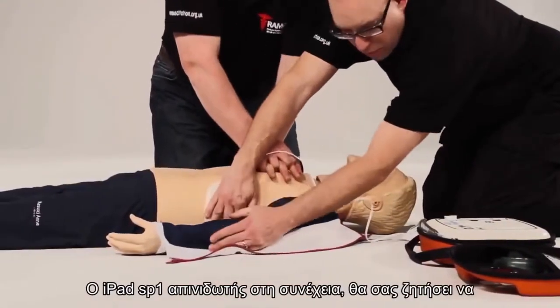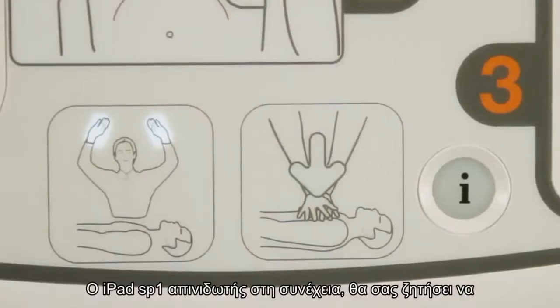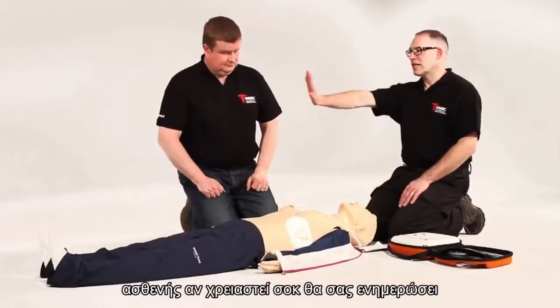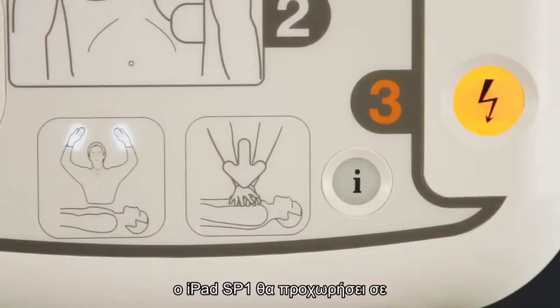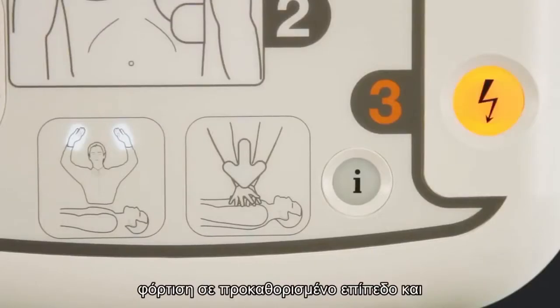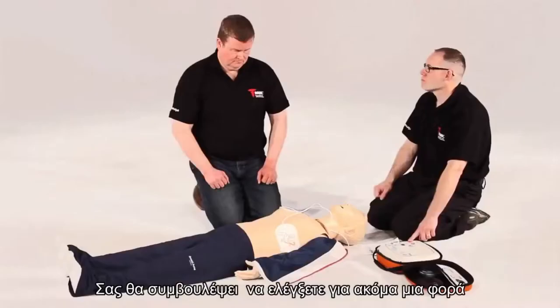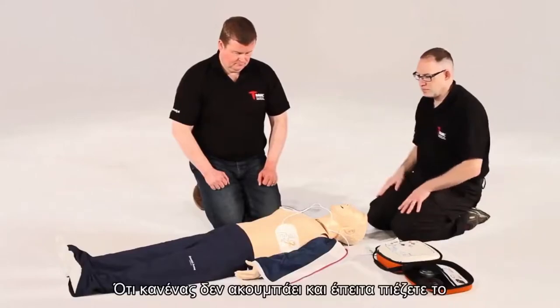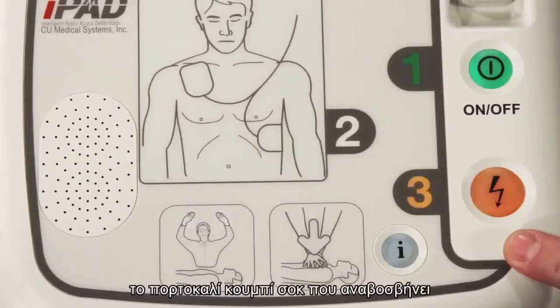The iPad SP1 AED will then prompt you to ensure that no one is touching the patient. Stand clear. If a shock is advised, the iPad SP1 AED will charge to a predetermined level and advise you to once again check everyone is standing clear and then to press the flashing orange shock button.